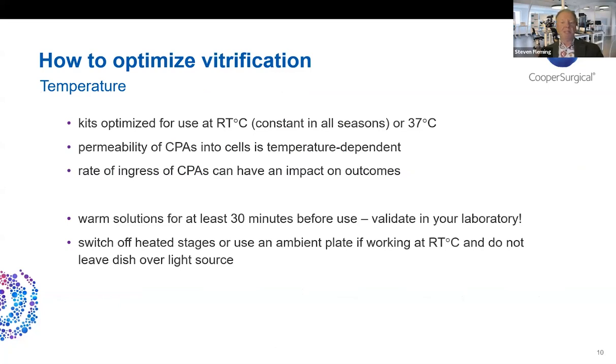But to achieve competence in vitrification, it's necessary to be consistent in all steps of the procedure and carefully manage the main parameters that can affect your results. And in this respect, you need to bear in mind that protocols are usually designed for use at room temperature or at 37 degrees C.